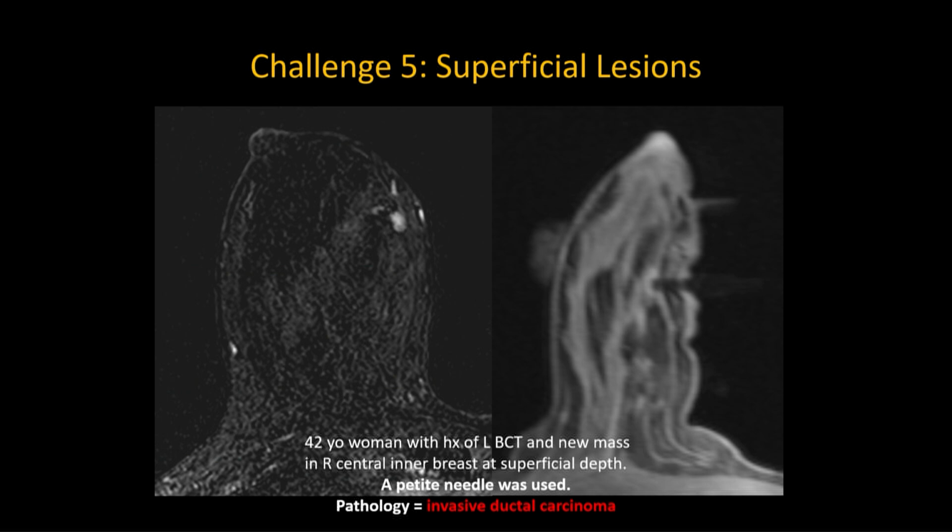So our next challenge case is superficial lesions. Superficial lesions can be very challenging because you don't want to biopsy the skin. And so this is a 42-year-old woman with a history of left breast cancer, and she has a new right central inner breast mass at a superficial depth. And so at the time of biopsy, you have to decide, are you going to use a standard or a petite needle? And I'll show you how you can determine that.